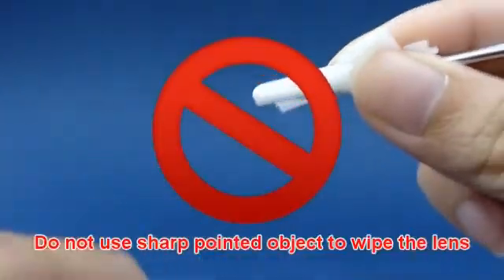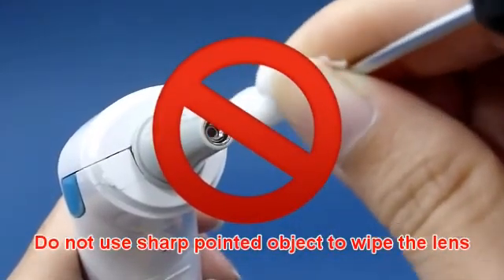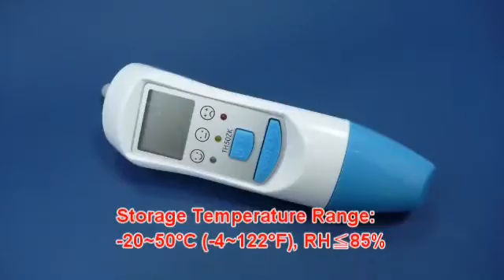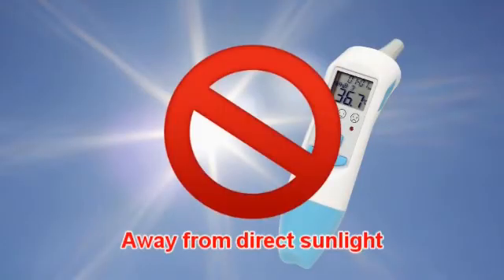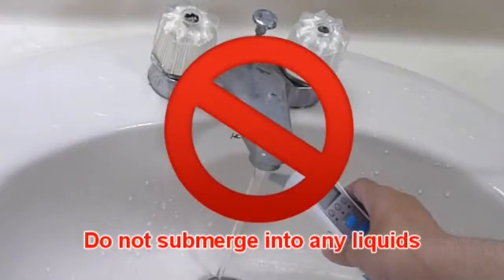Do not use a sharp pointed object to wipe the lens. Keep the unit dry and away from direct sunlight. Do not submerge the thermometer into any liquid.